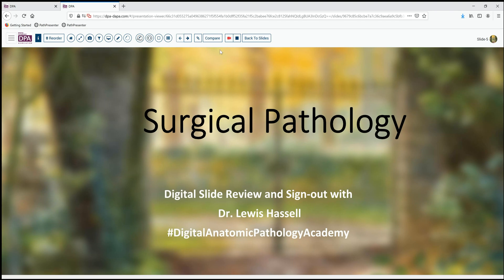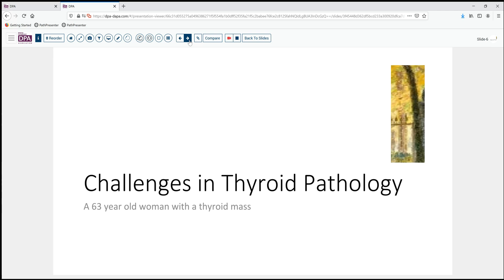Our case today comes from the realm of thyroid pathology. I've begun working on a thyroid project, and our patient is a 63-year-old woman who has developed a thyroid mass. At that age, that's not the typical age of benign goiters, and not surprisingly, the FNA revealed features suspicious for malignancy, and she was brought to resection.